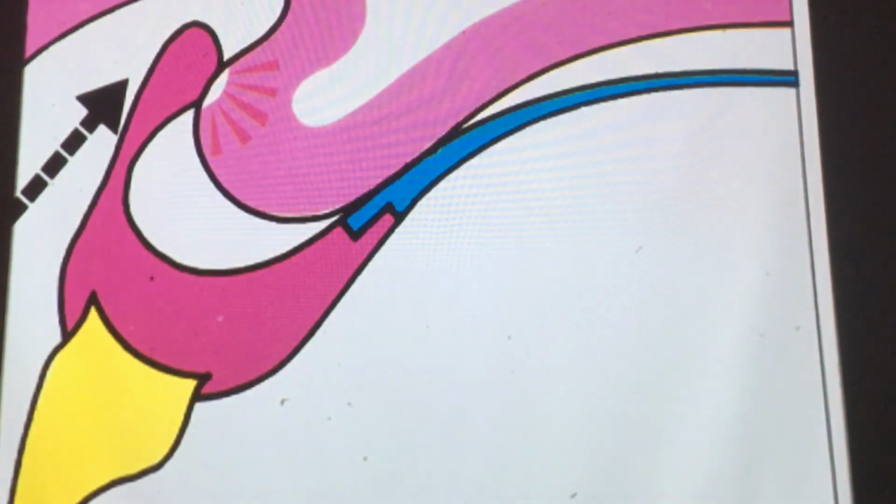Here we have our soft tissue undercut. This happens with your flange and your acrylic partial in the posterior section, and this has to be relieved. But if we blocked it out or changed the path of insertion, maybe we can have this denture going on an angle slightly lower, more anterior. You can see my arrow below the other arrow. Maybe change the angle slightly, and then we don't have to adjust this one as much.